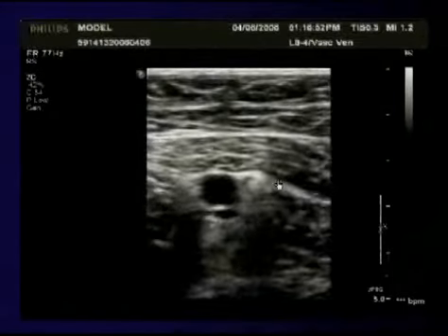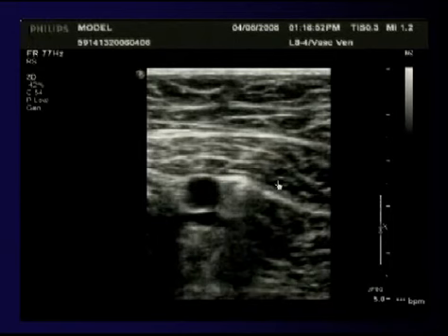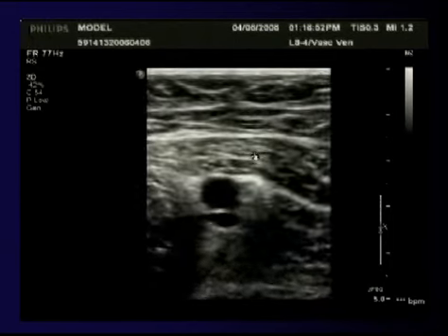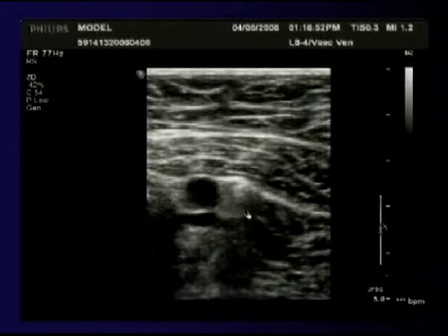Okay, now this is a cine loop of transverse compression. It is the most important part of the examination. I'm going to play it again. Okay, now the vessel that is completely coapting is the vein. We see the artery is on top. And it's very important to apply enough pressure to coapt the vein, to make sure that the vein walls come together.